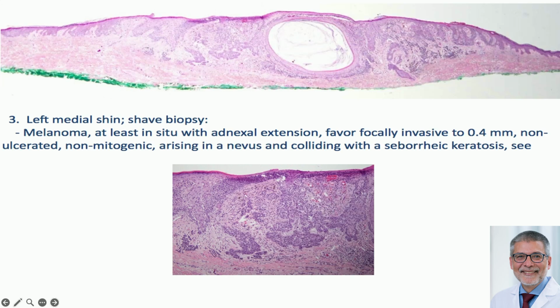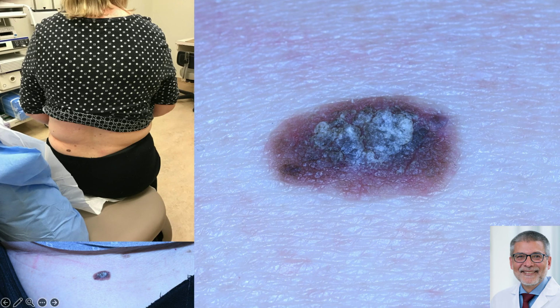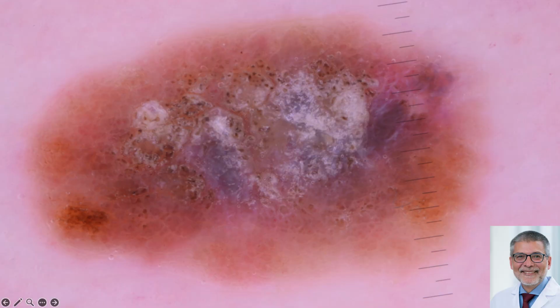So it will help you. I'll give you another example of how it helps. Look at this lesion. Of course, this is a seborrheic keratosis. Don't even put your dermatoscope on it. Well-demarcated borders, keratotic surface, can't be anything but a seborrheic keratosis. But what's the harm? Put the scope on it. When you put your scope on it, there is nothing here for seborrheic keratosis. You have atypical globules. You have milky red colors. You have irregular vessels. You have something called a negative network, which we'll talk about in the second part of this talk.